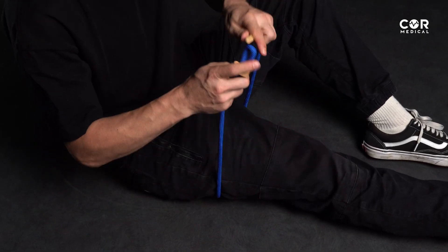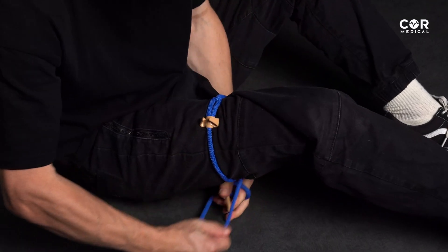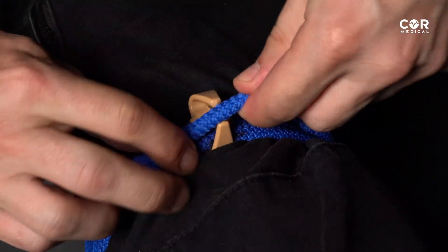Tests have demonstrated that the device can create five times the pressure required to fully occlude a limb's artery. The product's technical features allow you to instantly apply, tighten, loosen, and move the device even with one hand.